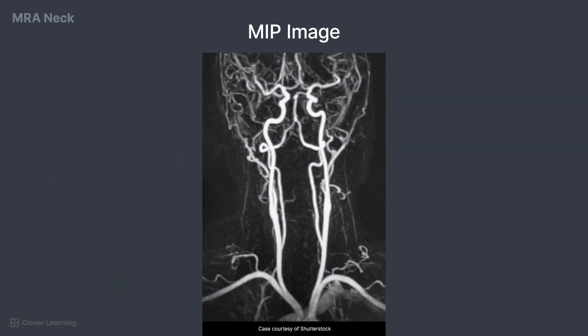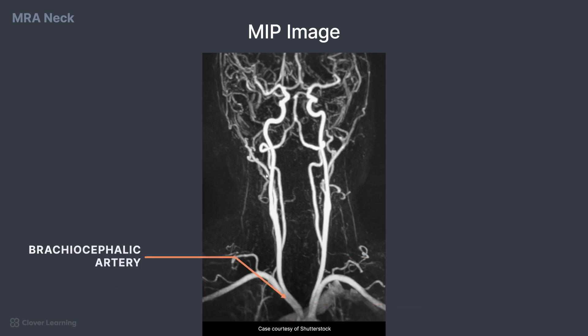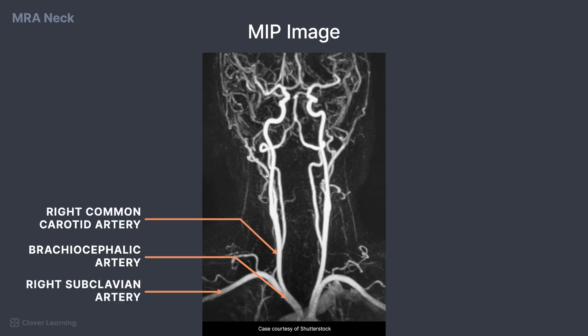Let's take a look at some important structures on a MIP image of an MRA of the neck. At the bottom of the image, the aortic arch can be seen where the brachiocephalic trunk, left common carotid artery, and left subclavian artery are originating. The brachiocephalic artery then branches into the right subclavian and right common carotid artery. The left common carotid artery originates from the aortic arch.